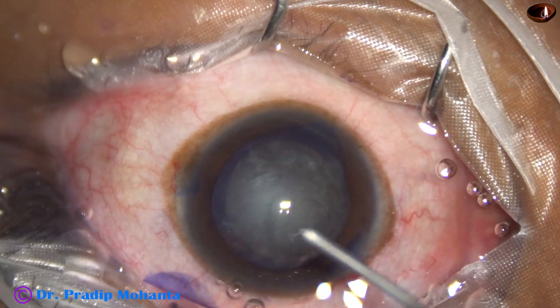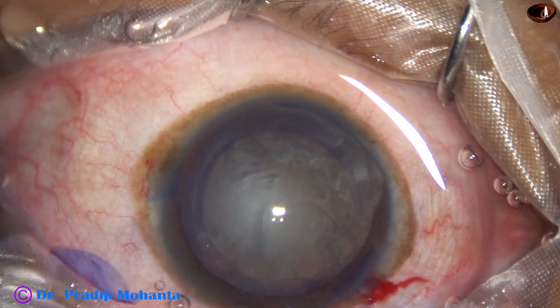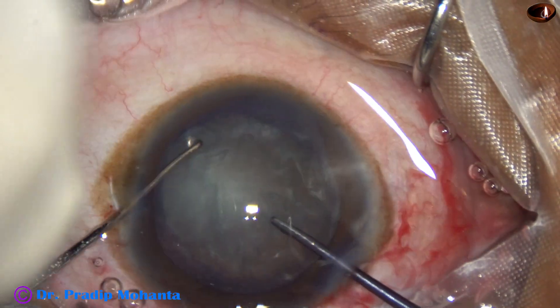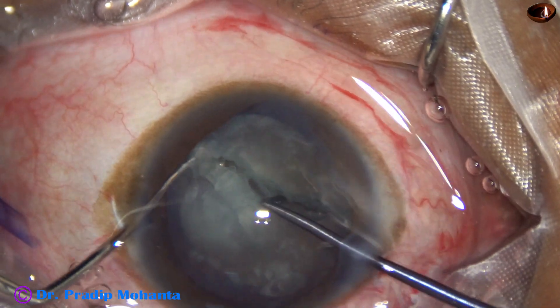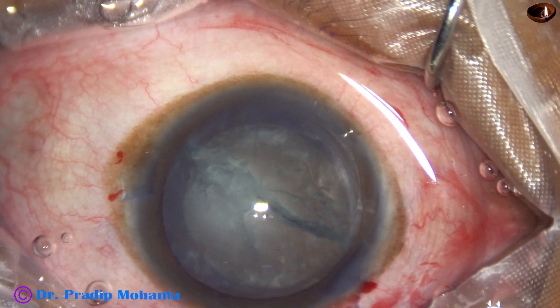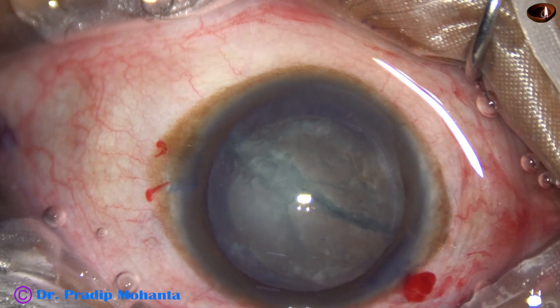Now is the time to manage the nucleus. The phaco needle goes in with its bevel down. Before that, this is division of the nucleus with the help of the pre-chopper. I am not sure whether I have made a rent at this time itself — probably not.